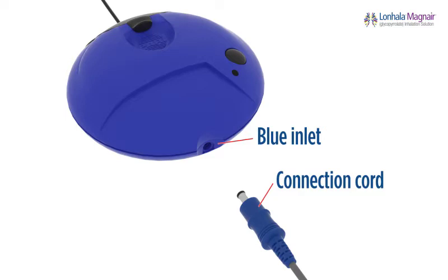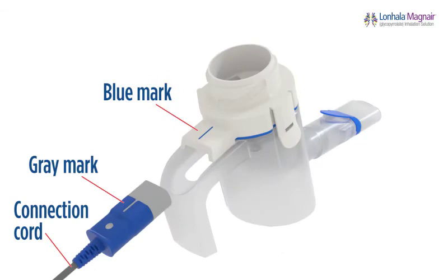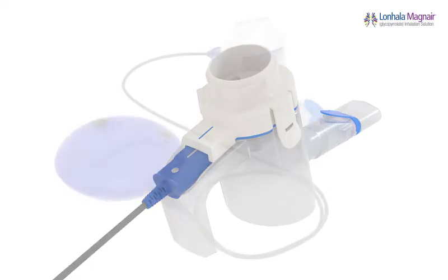Now connect the controller to the handset body using the connection cord. The blue round end of the connection cord goes into the blue side of the controller. You will hear a slight click when it is fully inserted. Do not insert into the AC adapter inlet on the black battery compartment. Insert the gray end of the connection cord into the handset body. The gray mark on the connection cord should face up and line up with the blue mark on the handset body.